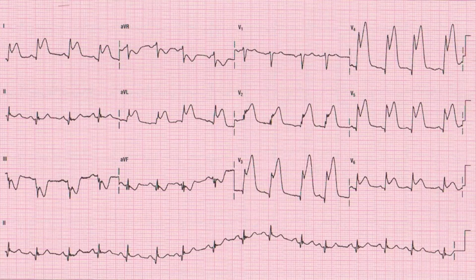All right, this is how you answered. And let's see. Lead 1 is elevated. Lead 2 is slightly elevated. Lead 3 is depressed.